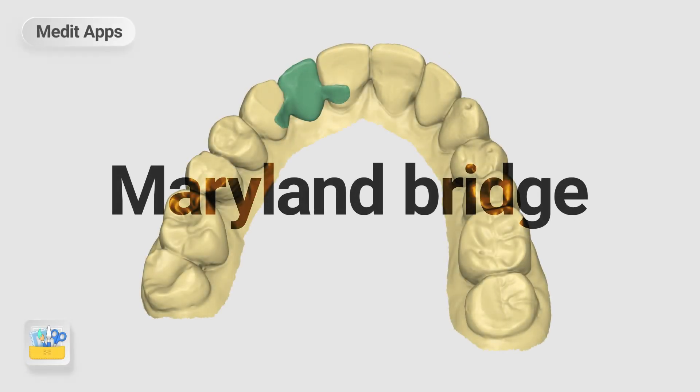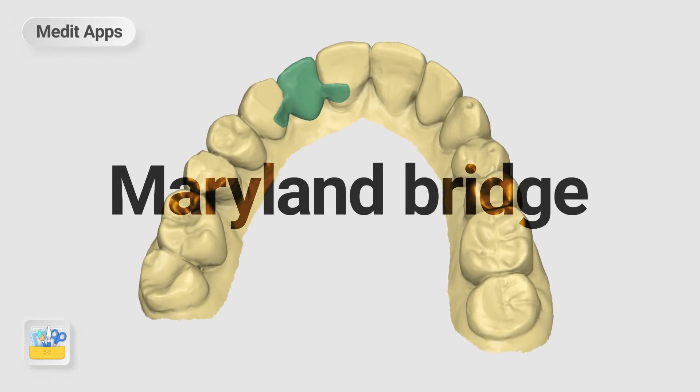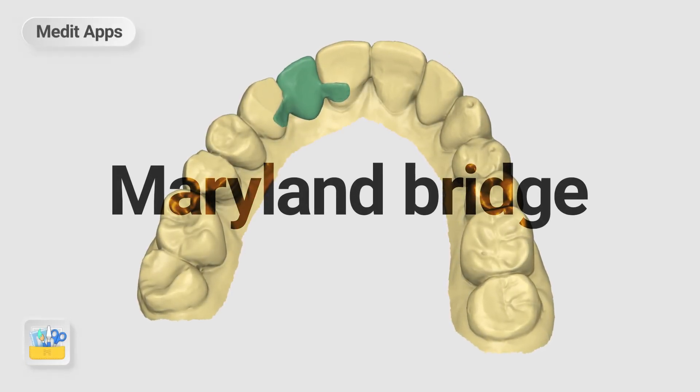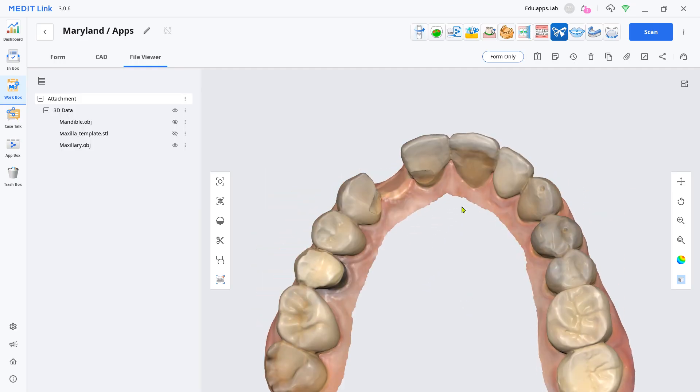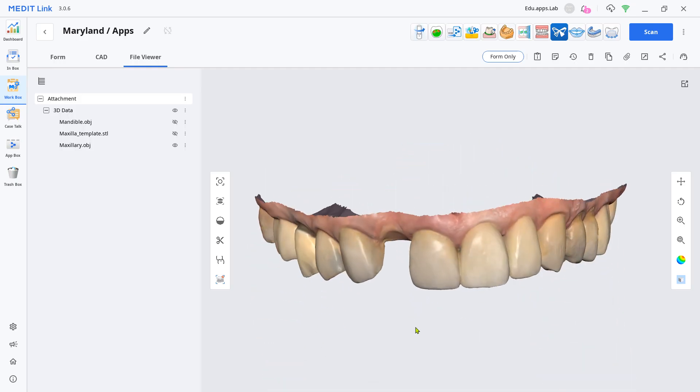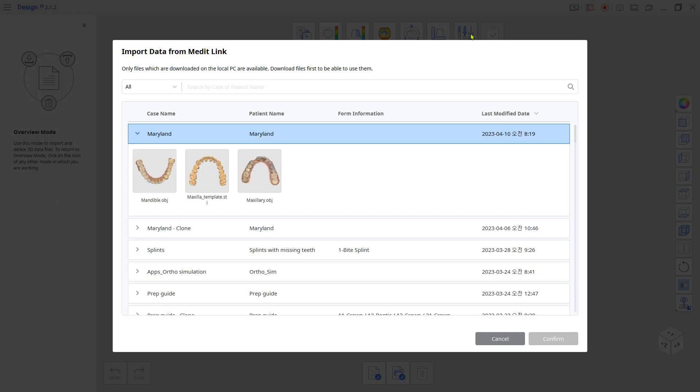This is a quick guide on how to design a Maryland bridge with the Design App. Load the scan files from the Design App.